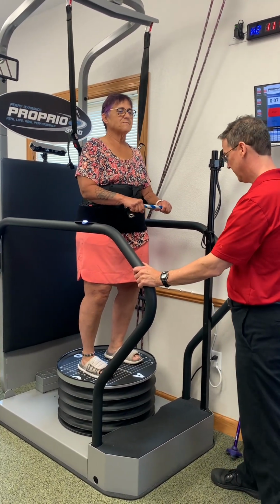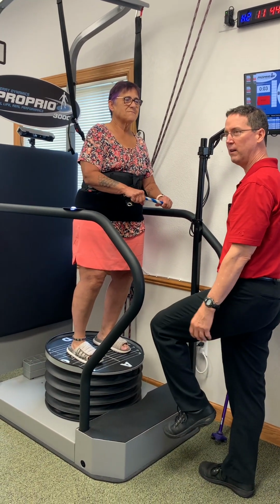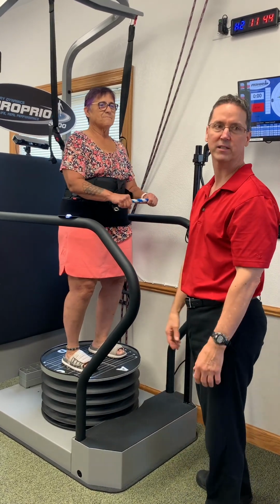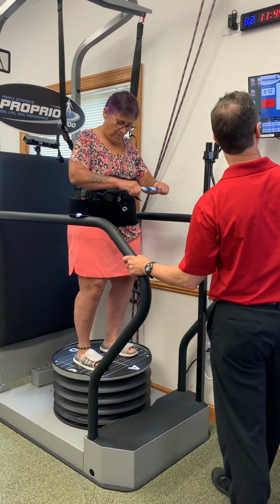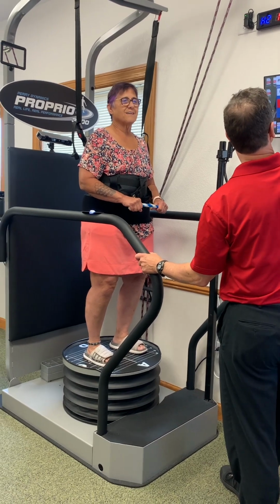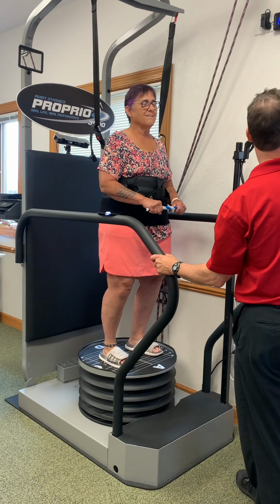We could talk about simple tests like, hey, can you stand on one leg for a little while, and is that good for your balance? Yeah, it's good for your balance, but it doesn't tell you how real life operates. You're better off for doing that than not doing that. But this is really good. Not quick. So now you get a 15-second pause. So this will work muscles. This will work everything. Yeah, that's pretty good.